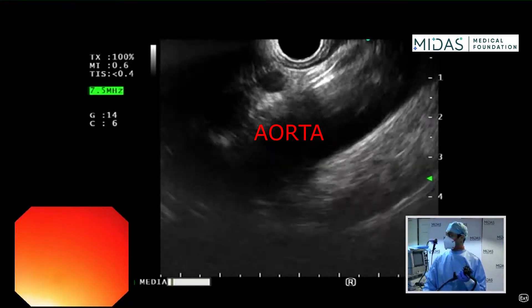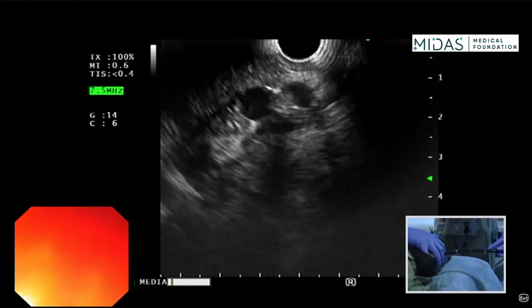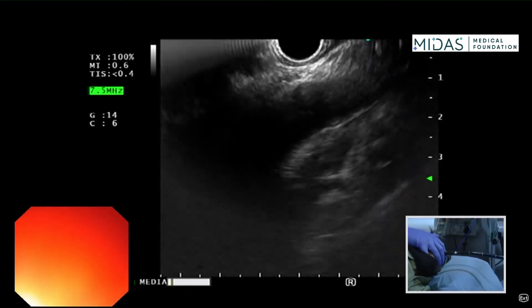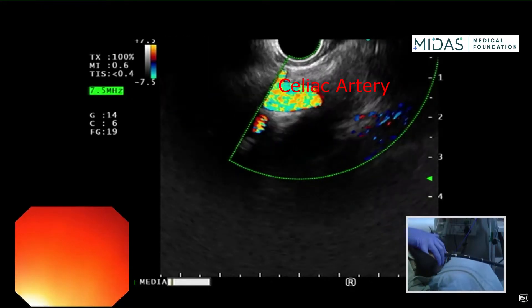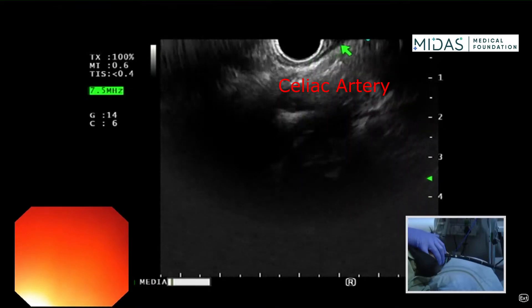What you have to identify is the celiac artery takeoff. Here the celiac artery is coming right there. As I torque the scope, it's coming slightly on the right of the screen — that's the celiac artery takeoff. And the crura of the diaphragm are just over here.